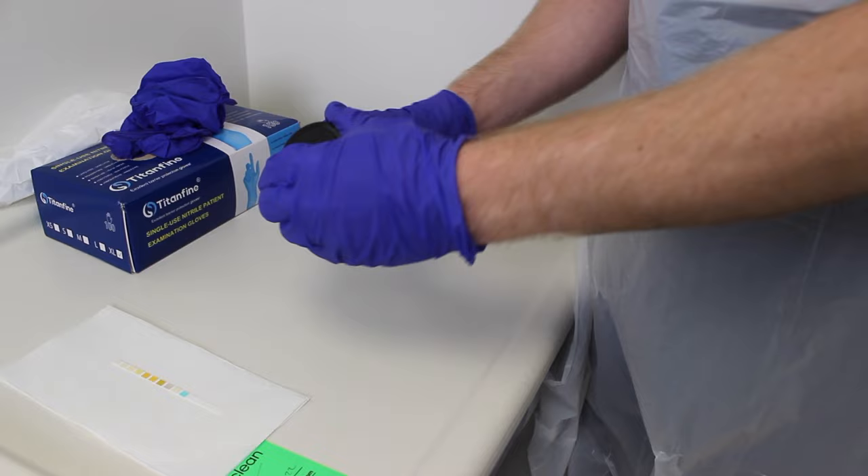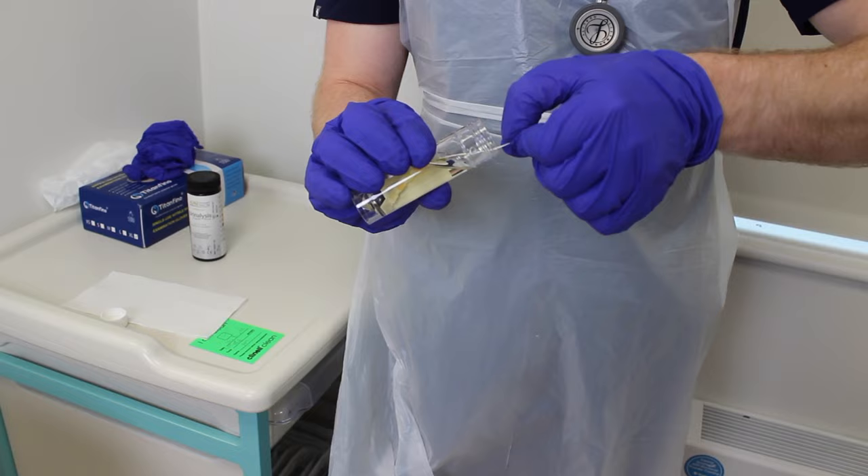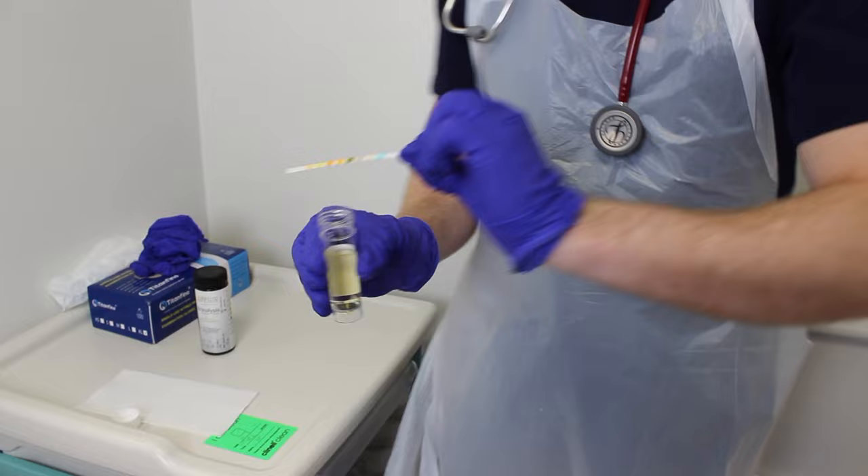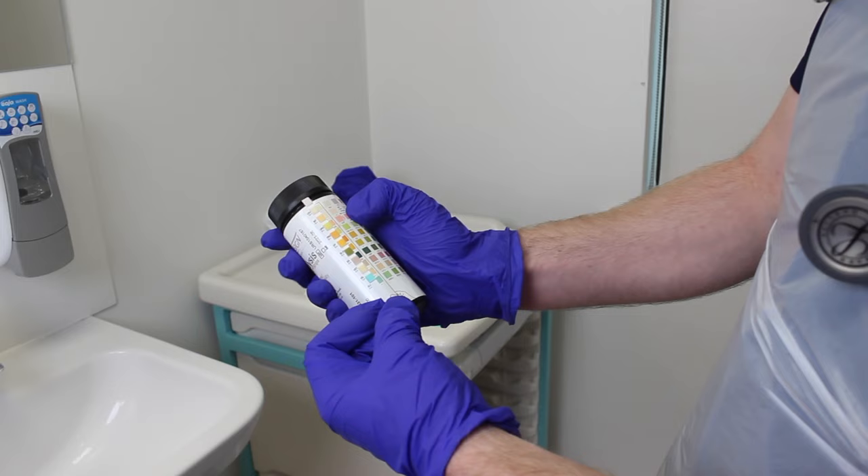Next, dip the dipstick into the urine ensuring that all squares are covered. Remove it immediately. Wipe off any excess urine on the edge of the sample pot. This helps to avoid mixing of chemicals from adjacent reagent areas.